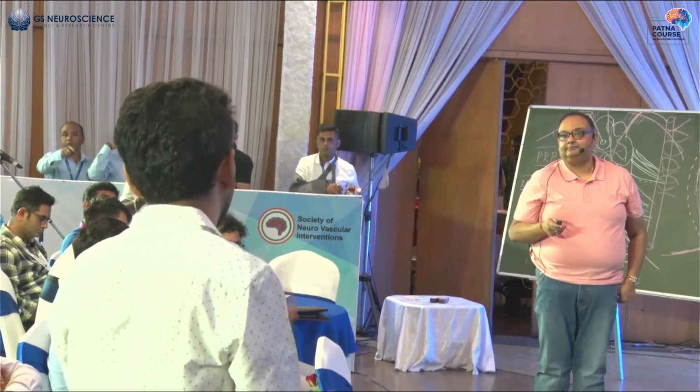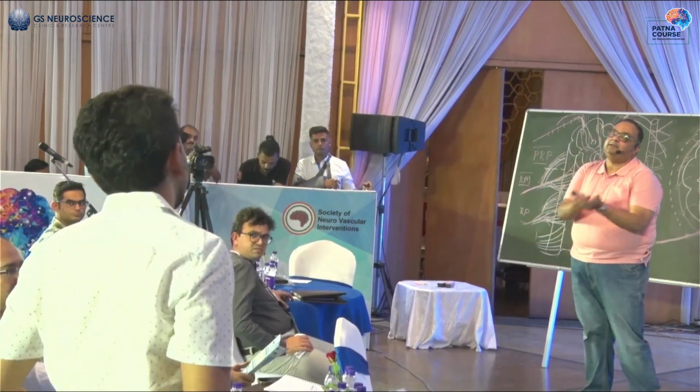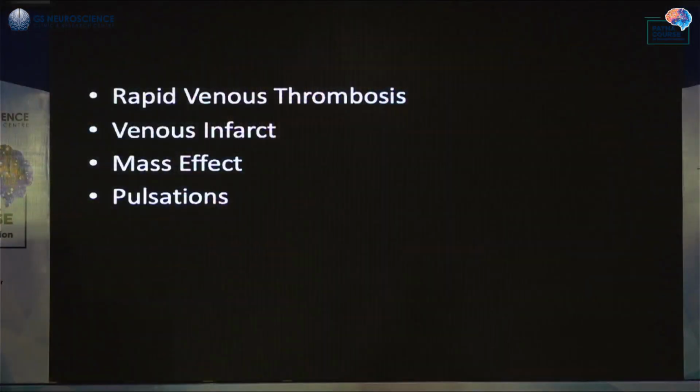You can't. But why do you want an undershoot? Because, what are you trying to see in an undershoot? You already have your roadmap. You already have a microcatheter in. So subsequently, all the runs will be from the microcatheter.